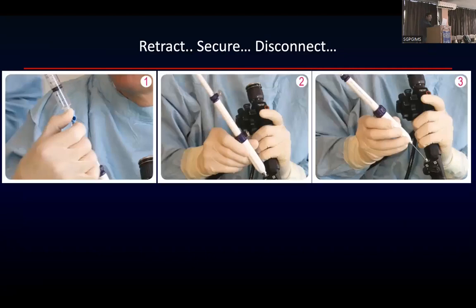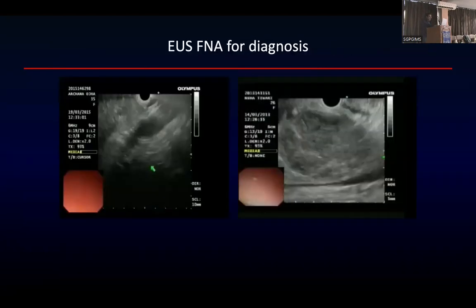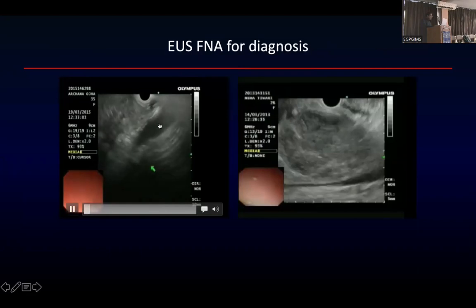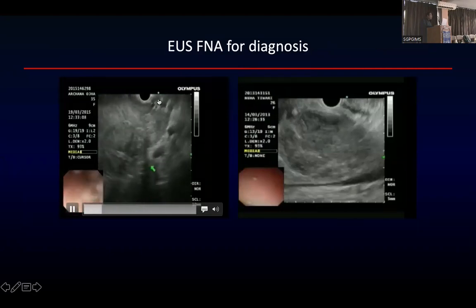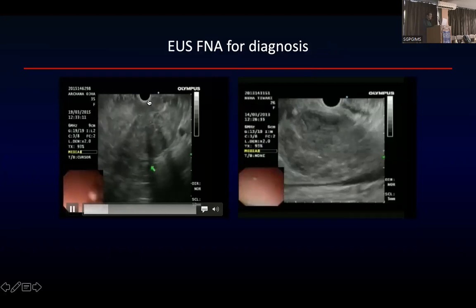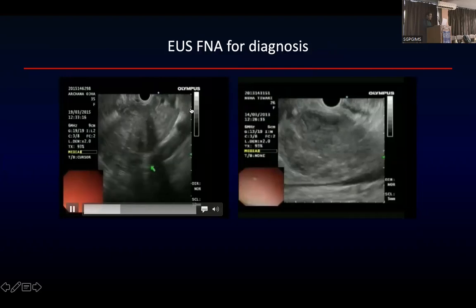Retract, secure, disconnect. आप निकाल दिया और फिर आपने ये मटेरियल बना दिया. So I'll just show you. These are few of our patients. FNA कैसे कर रहे हैं? एओटा है, ये सीलियक है, लार्ज मास इन दी बॉडी ऑफ पैनक्रियास, है ना. फिर आपने सबसे पहले आप डॉपलर लगाएंगे यहाँ पे. यू अप्लाई डॉपलर.